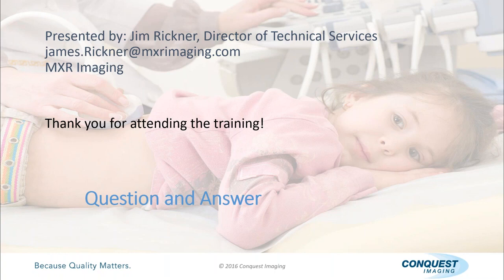So there are some differences between the different Phantoms. I prefer the gel-based, but some people say Gammex has a better image quality. Great, they have better image quality, but I have to have them calibrated all the time.